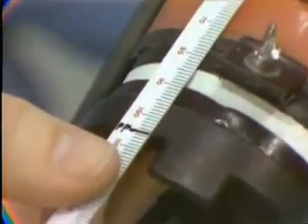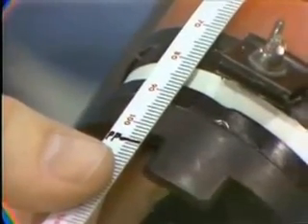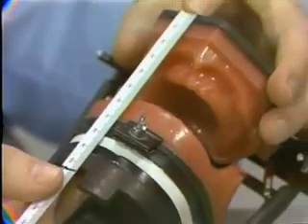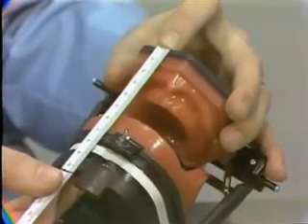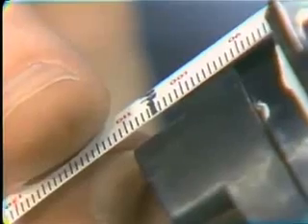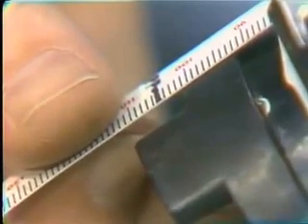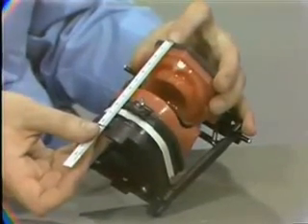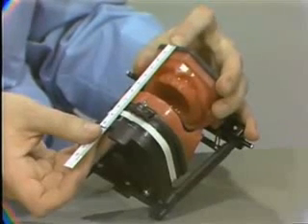But as I go through, I'm going to close down until I reach a measurement of 101 millimeters. And because all these mountings are identical, we will consider the patient's vertical dimension at 101 millimeters for this case. So everybody's tooth setup will be the same. We'll all have the same space to set teeth, and it makes a more efficient teaching procedure. So the number to remember is the patient's jaws are held at a vertical of 101 millimeters.